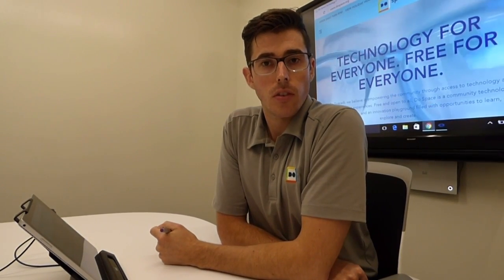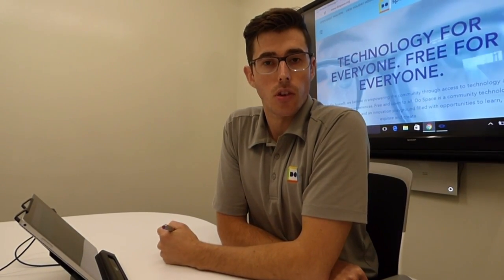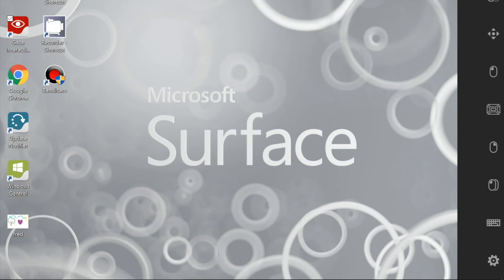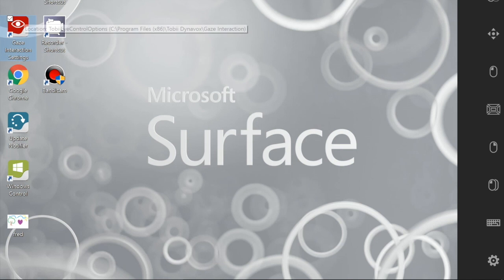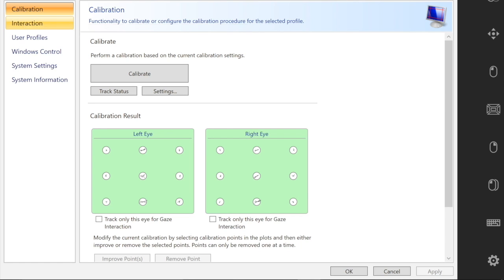I will narrate my actions so that you can further understand what I'm doing. I'm going to use the stylus to select the gaze interaction settings icon on the desktop. This will take me straight to the calibration settings.